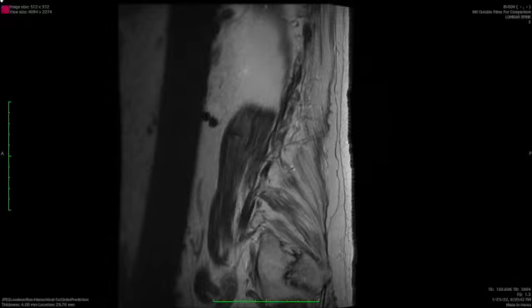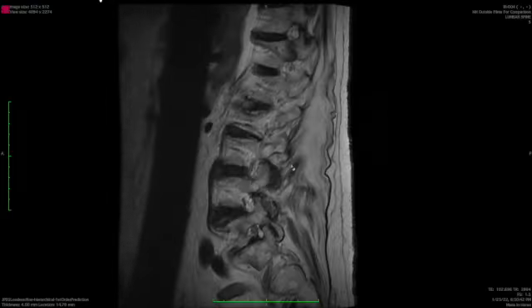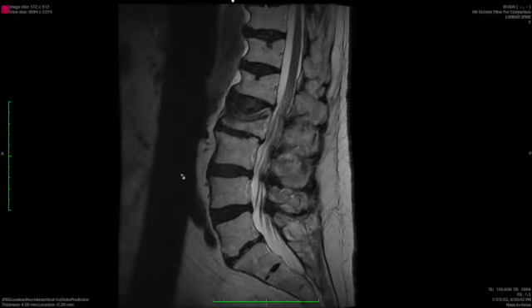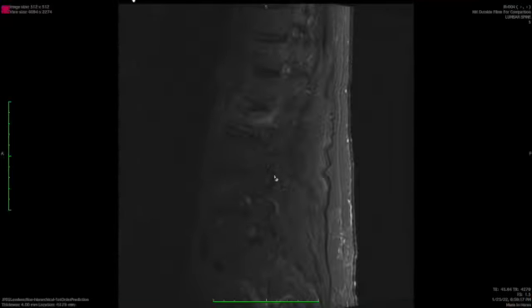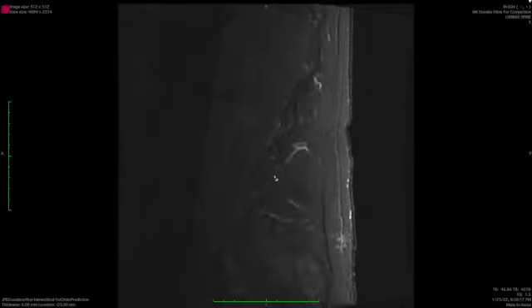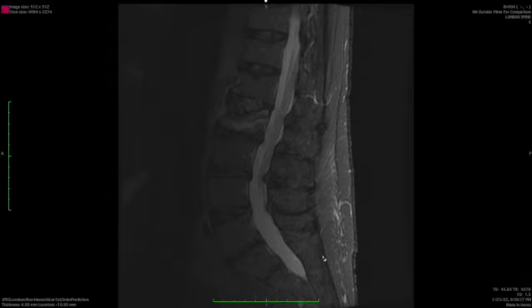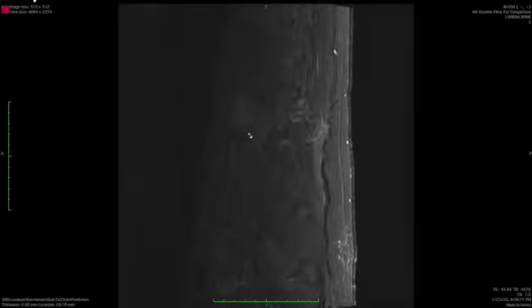It starts with proving that the vertebral body is acutely fractured because our intervention is not going to help pain in people who have chronic fracture changes. We do that by getting an MRI. The STIR-weighted images highlight areas that have edema, which correspond to areas of acute fracture. We have vertebral body height loss here and the marrow is bright, indicating edema in the marrow space. So this is an acute fracture and thereby is eligible for intervention.